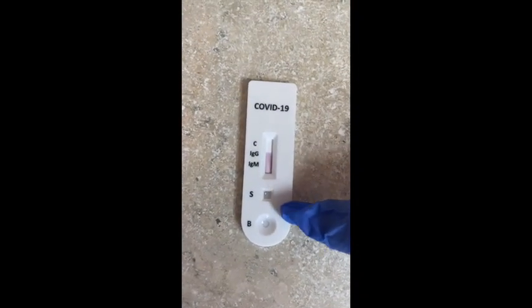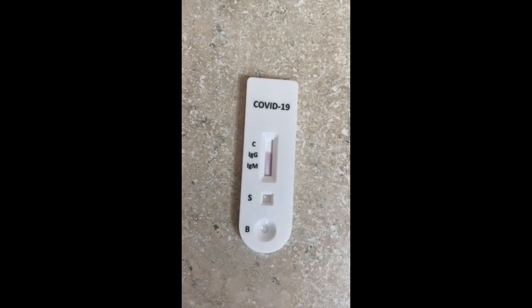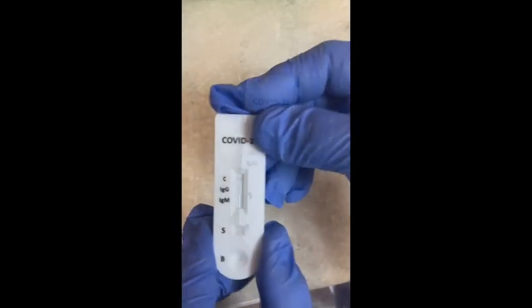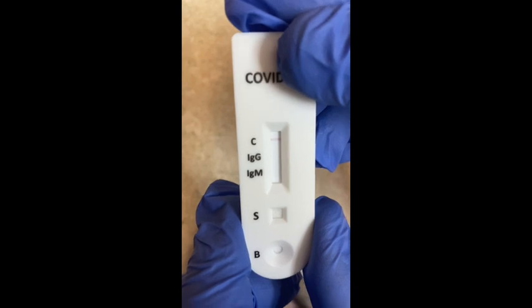You can see the buffer go up the cassette, and that's what you want to see. Here's the final result, and it is a negative.